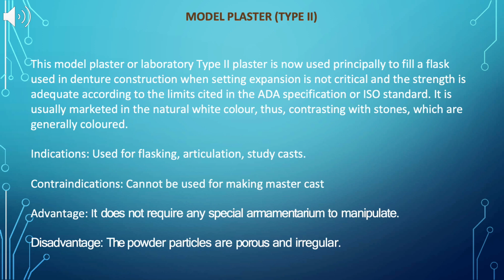Indications: used for flasking, articulation, study casts. Contraindications: cannot be used for making master cast. Advantage: it does not require any special armamentarium to manipulate. Disadvantage: the powder particles are porous and irregular.